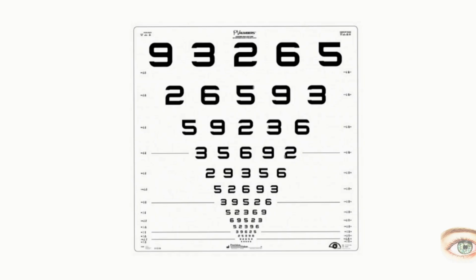First, I want you to look at how the LogMAR chart looks. Now, this is a LogMAR chart, and you can see that there is equal spacing between the optotypes and equal line spacing, right? There are an equal five optotypes on each line, and equal spacing between the optotypes and between the lines.